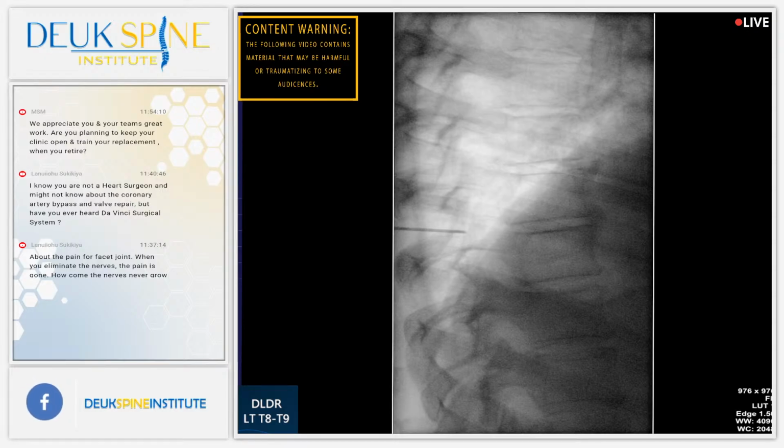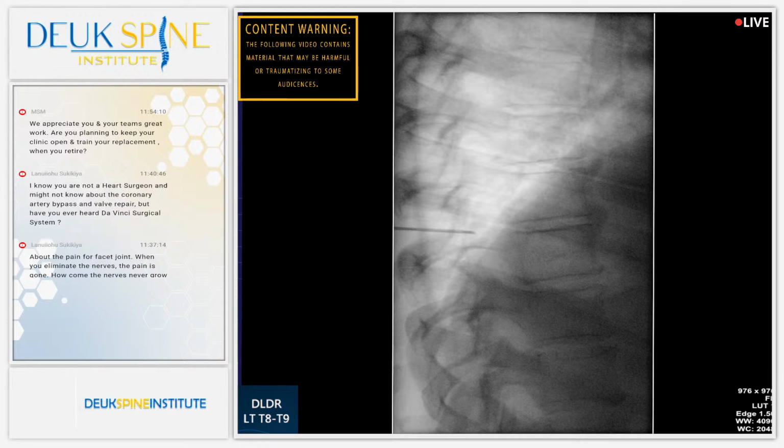Shot. It's, in this case, the rib head and facet. AP.